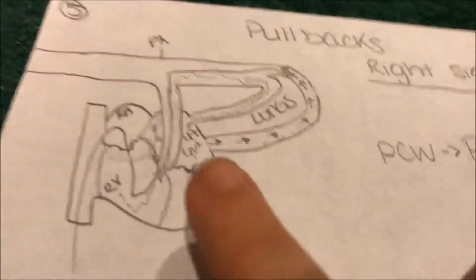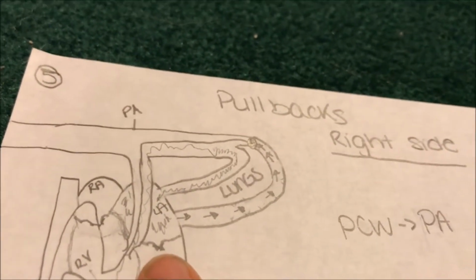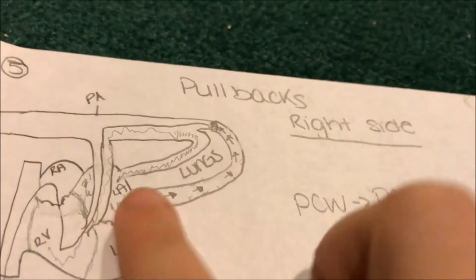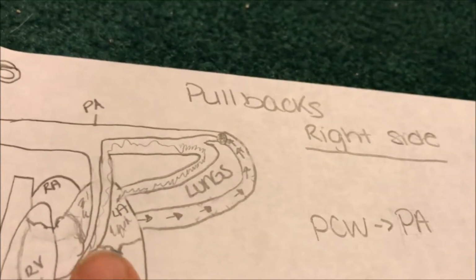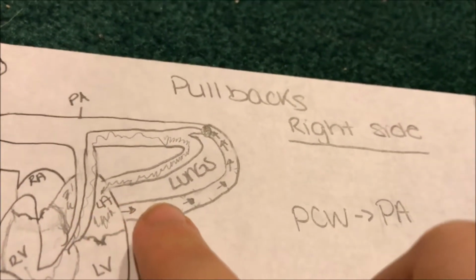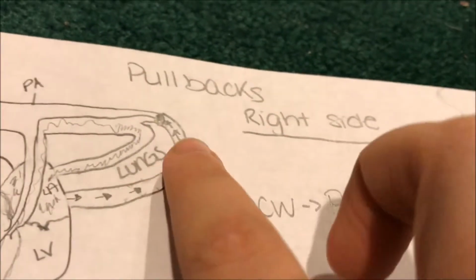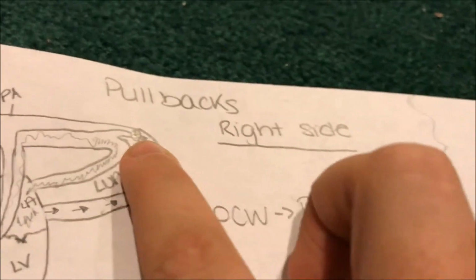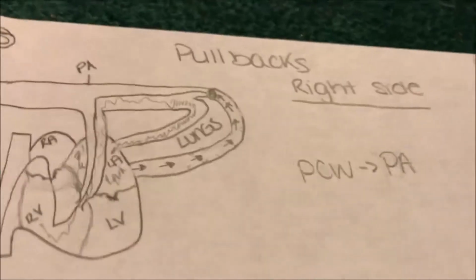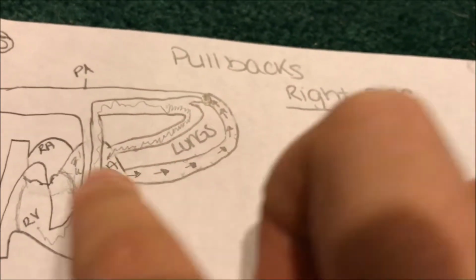Now what happens here is you're in the left atrium. This valve is currently closed. There's going to be backflow. You're going to have a lot of blood going into this chamber, and blood likes to go to the lower pressure. So blood is going to come out here, trying to figure out where else it can go. It meets up with the end of that catheter, which will actually give you the pressure of the left atrium, because at this point, this is all one common chamber.